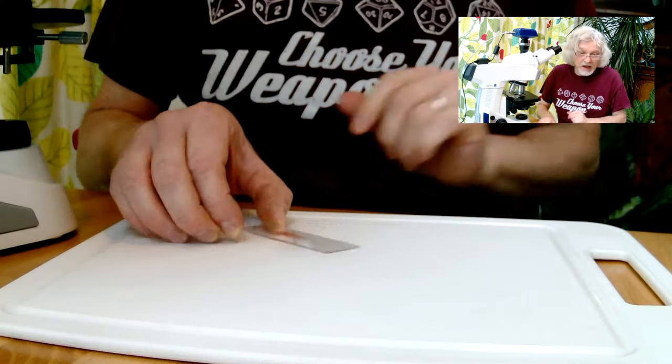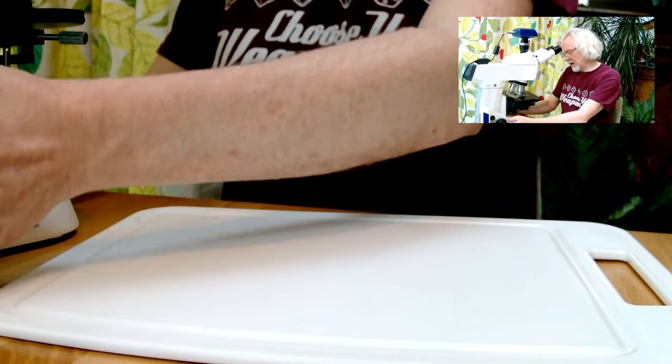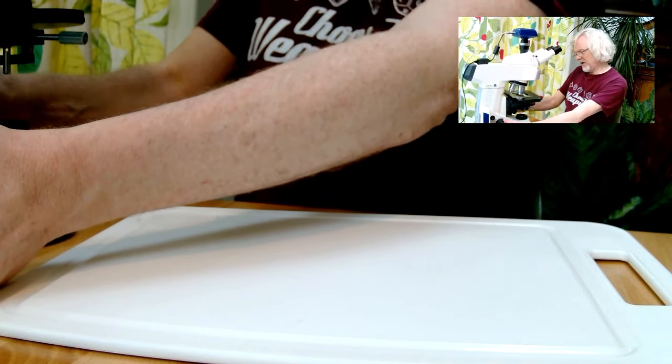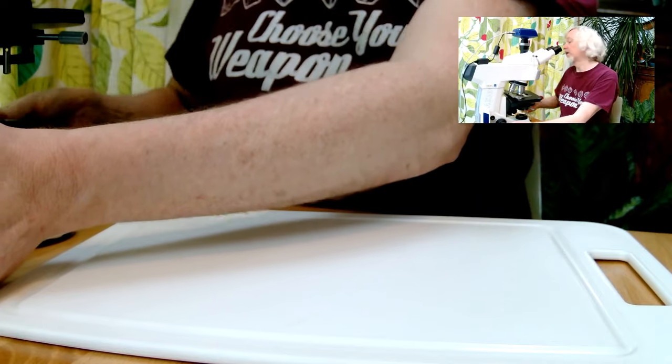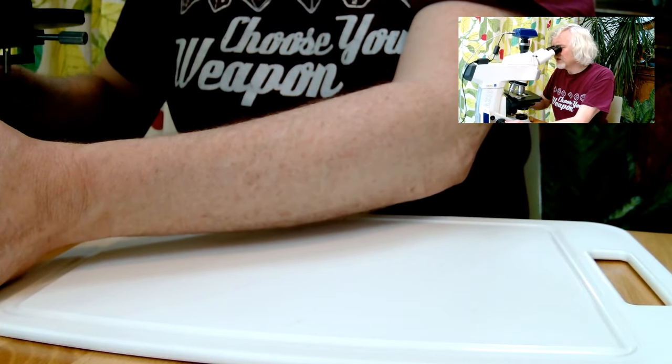Let's have a look then. This is now dried. I'm going to put it underneath the microscope, and I'm going to just have a quick look to see if we've done a good job of this. Yep, it's a bit thick. This is a good section just here.